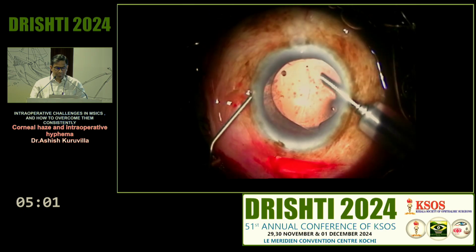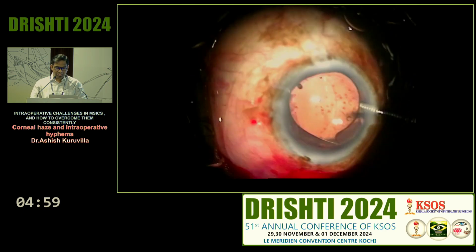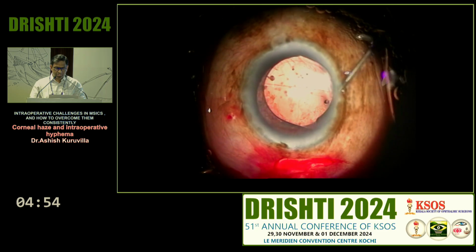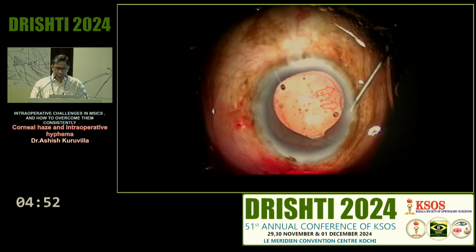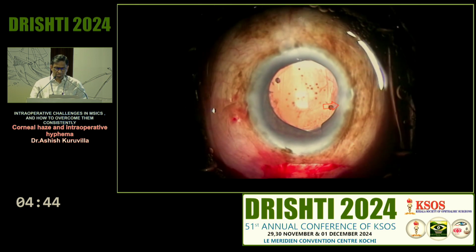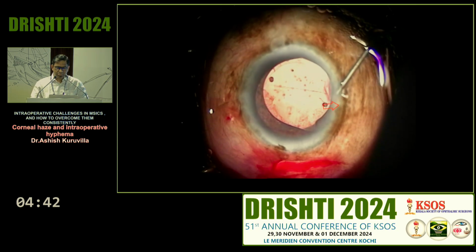Now, what other problems come with this peripheral corneal degeneration? This is one such case, everything is over, it's finished, and then you're just hydrating. In the last step when you're hydrating, you can see those two bumps over there, where the arrows are pointing, and when you're hydrating, have a look at what happens to that bump. It has gone and become a Descemet's detachment in that area.